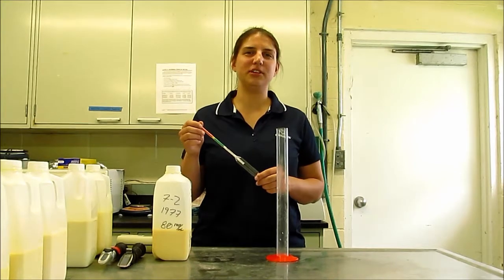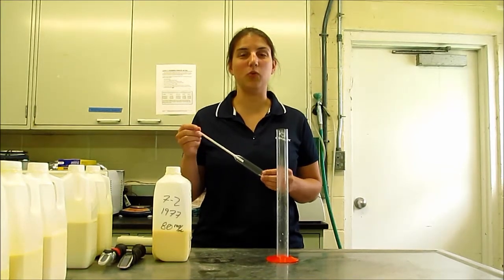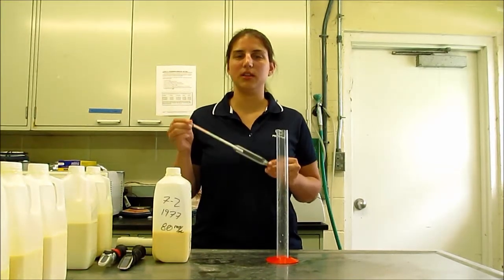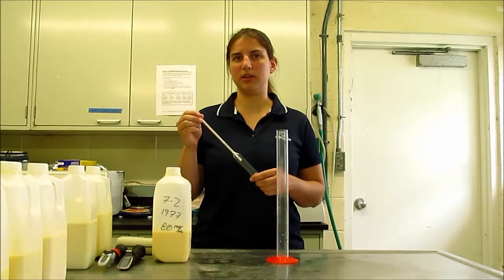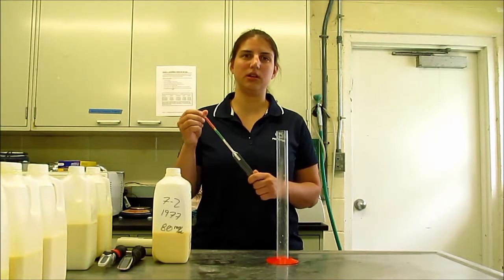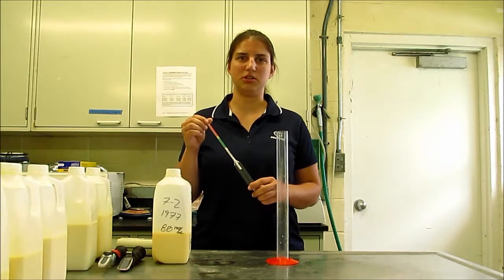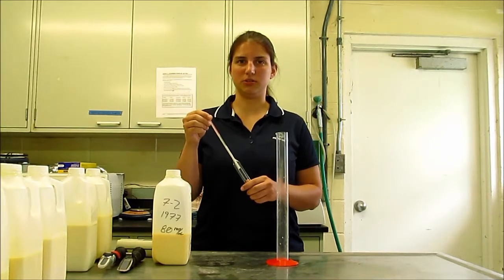There's a couple of different field tools that we can use to measure colostrum quality. One of them is a colostrometer. A colostrometer is a hydrometer that uses the correlation between colostrum density and IgG concentration to give us a measure of colostrum quality.